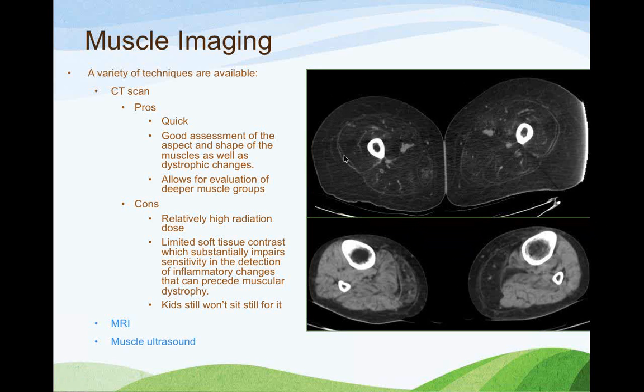And it's really interesting because you're looking at this patient, who's actually an adult patient, and you're seeing that this subcutaneous fat is of the same intensity as the muscle, which means that this muscle is actually all made of fat. So this muscle is no longer mostly muscle, it's mostly fat, and this patient was severely compromised. We ended up getting a CT scan on her recently because she couldn't lie flat for the MRI for too long because of her respiratory issues, and she hadn't yet been intubated. So this was the quickest study that we could get.